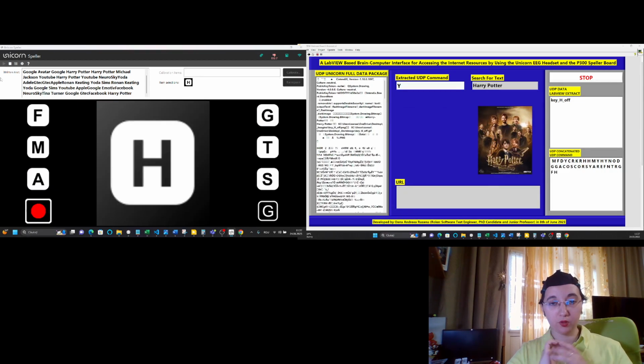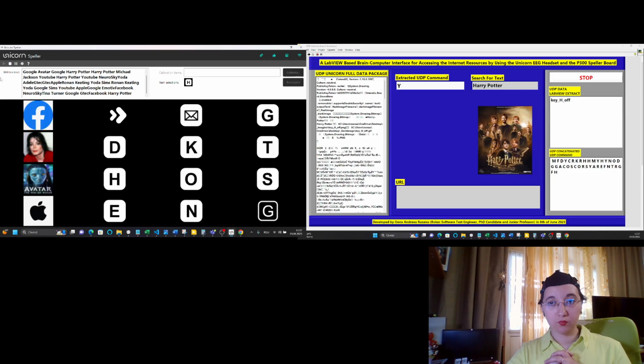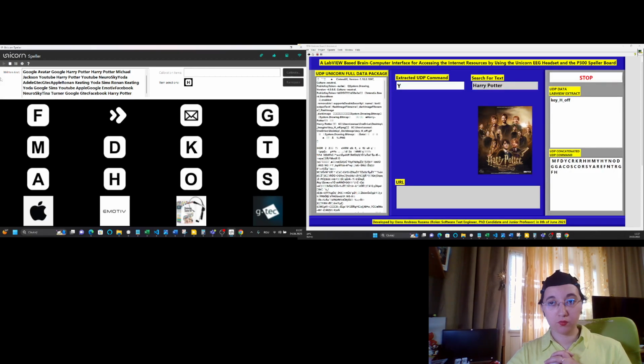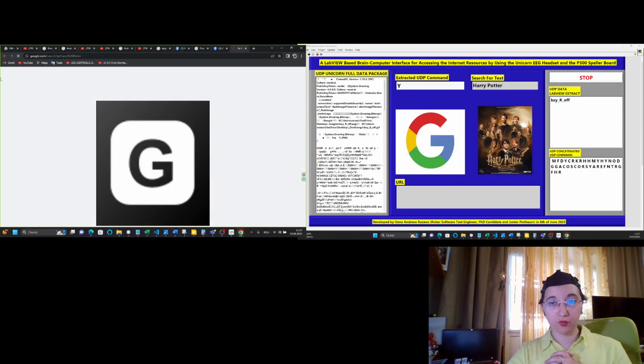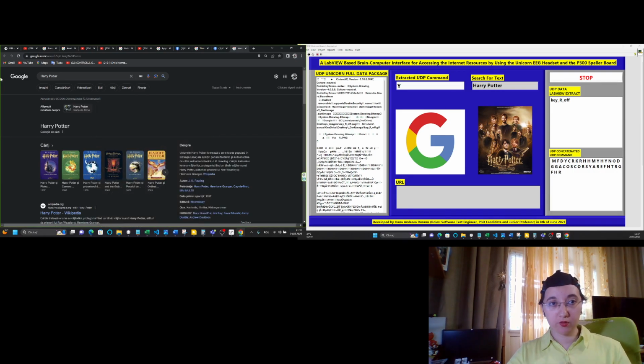Okay, Harry Potter was detected. Now Google. Perfect. So Google web page is opening and is searching for Harry Potter.